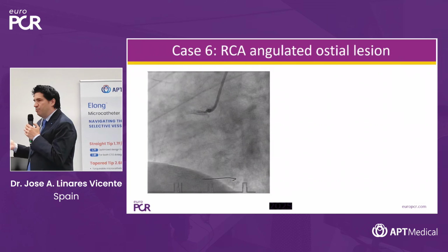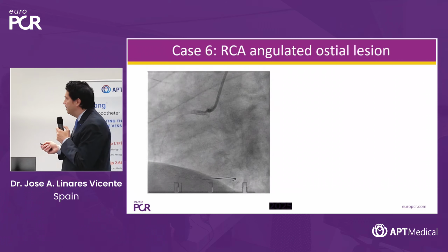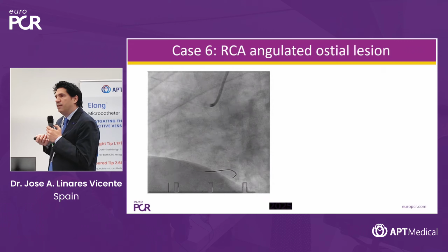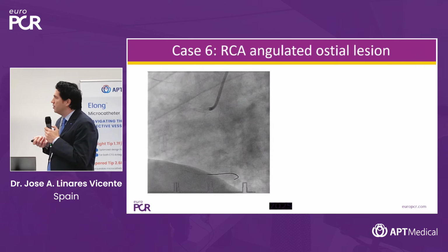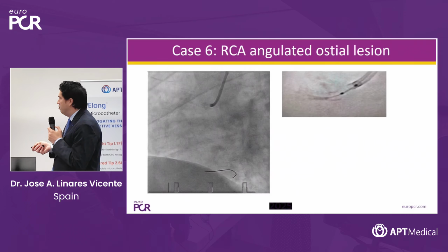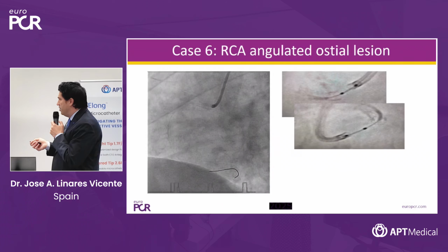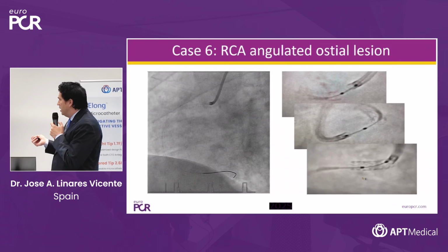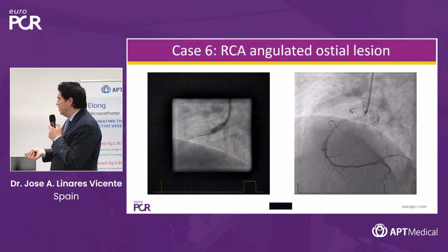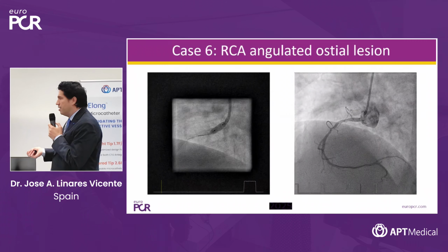Obviously, we always perform an aortostial dilatation, but this is a case I did personally. I used a regular NC balloon, and I could feel how the tapered tip balloon crashed into the stent, and I was afraid of having a mechanical complication. And as you can see in the stent boost, a short CONQUEROR with a spherical tip goes into the stent easily and without problems, permitting an ostial dilatation to finish the case safely.